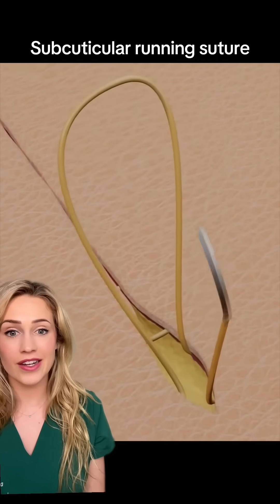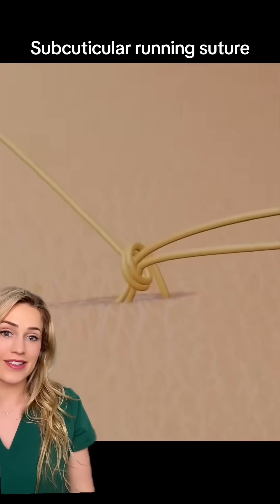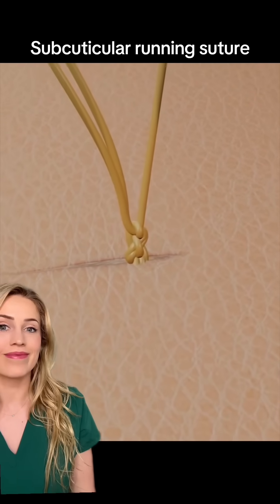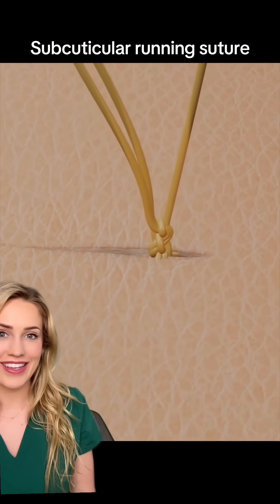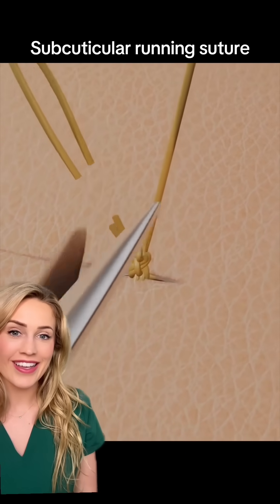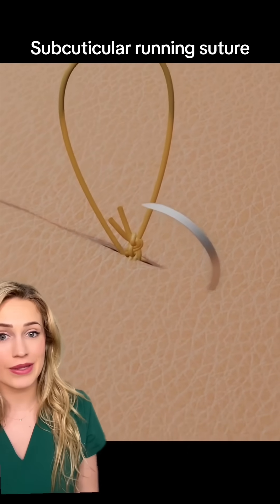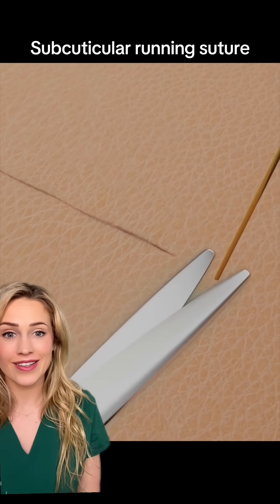They're finishing off here, and you're going to see how they bury the knot. First they tie the knot and cut off the extra. Then they swoop in and bury the knot deep in the skin so that it's all completely under the skin. Beautifully done.